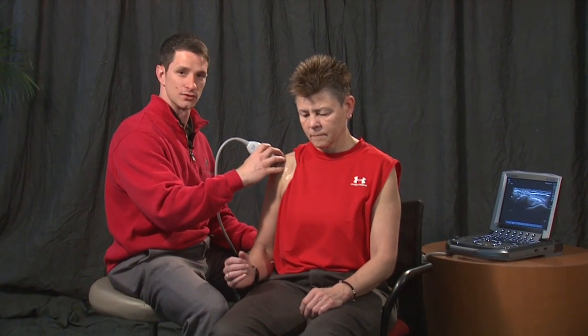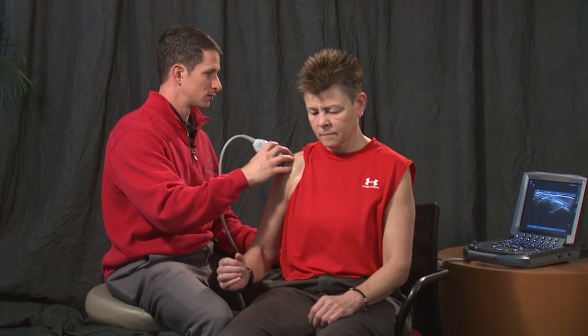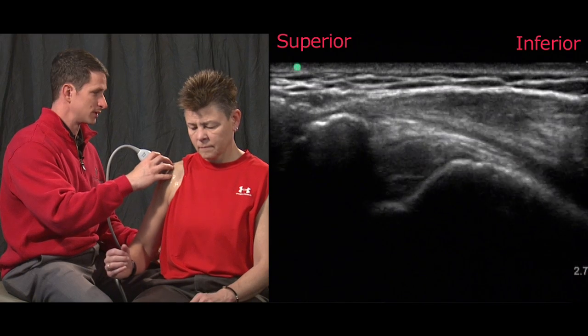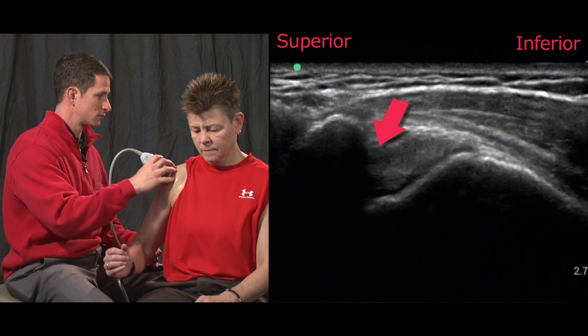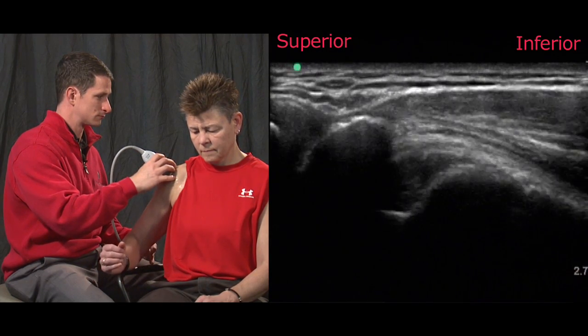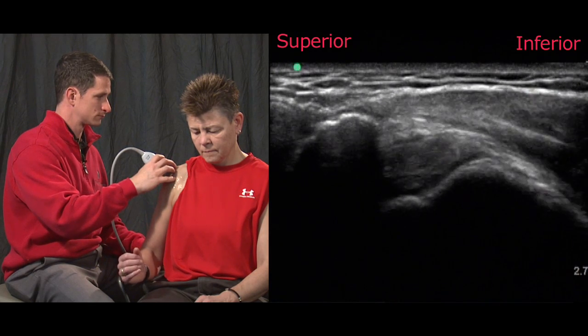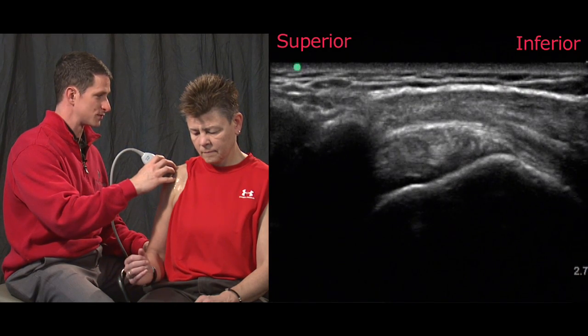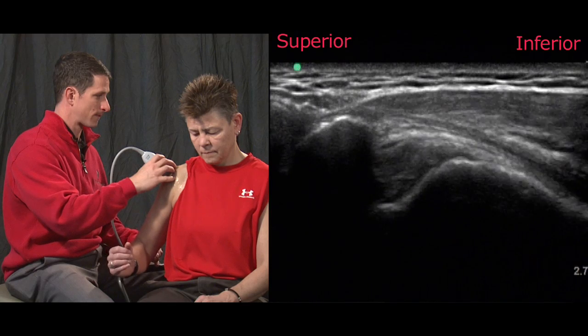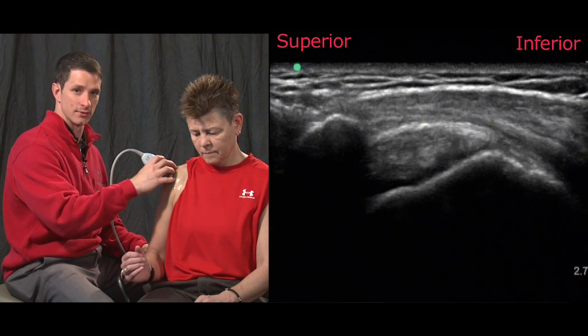Once we've found our position for the acromial humeral distance, we'll do a subacromial impingement test by asking the patient to slowly abduct or elevate their shoulder laterally as we assess for pooling or bunching of tissues beneath the lateral edge of the acromion with elevation. As you can see, the supraspinatus is gliding beneath the acromion and we're not seeing any subacromial impingement.